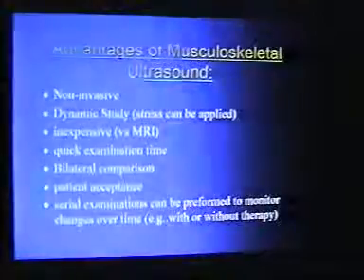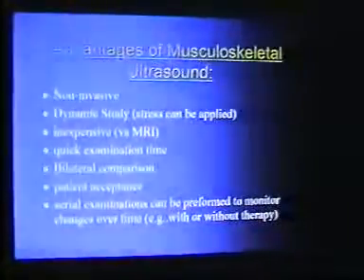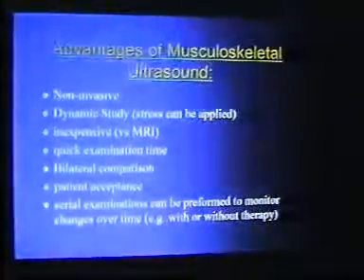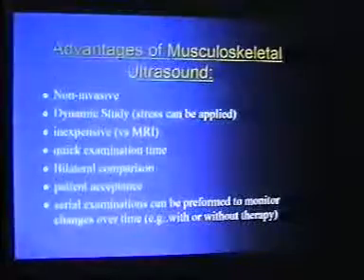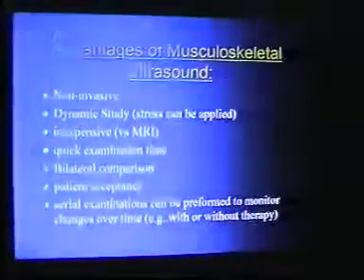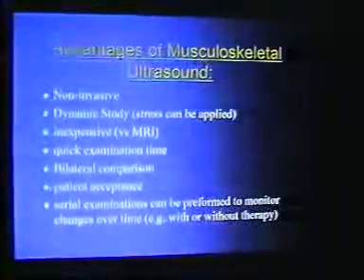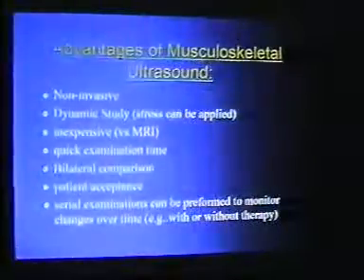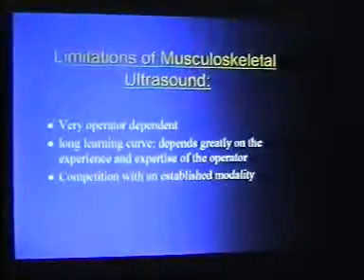First of all, we will be discussing the advantages of musculoskeletal ultrasound. It is non-invasive. It has the facility of dynamic study. Stress can be applied. It is inexpensive versus MRI. Quick examination time, bilateral comparison, patient acceptance, serial examinations can be performed to monitor changes over time, for example with or without therapy. There are a few limitations of musculoskeletal ultrasound.